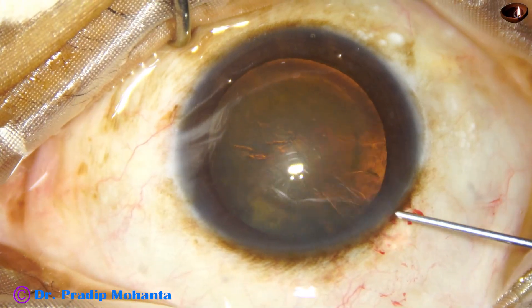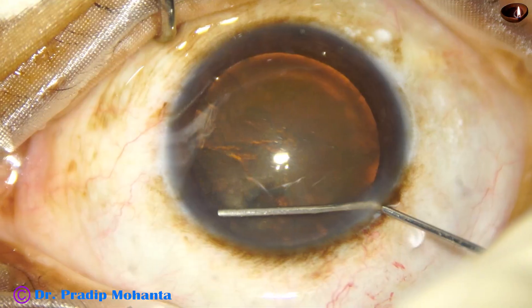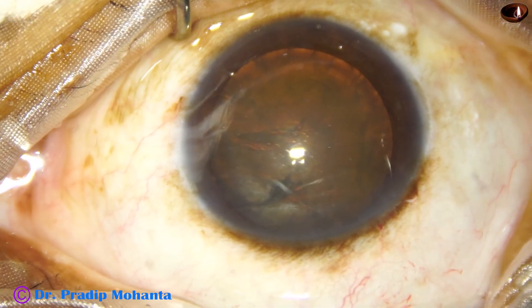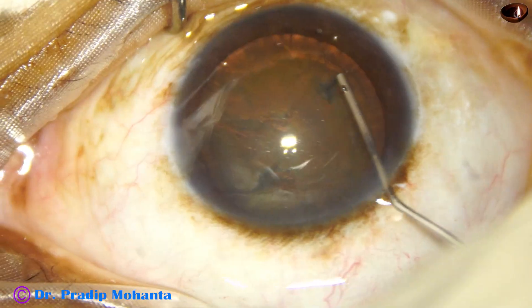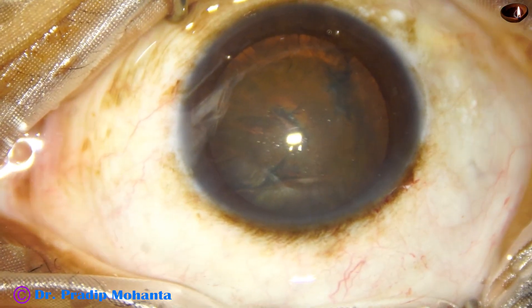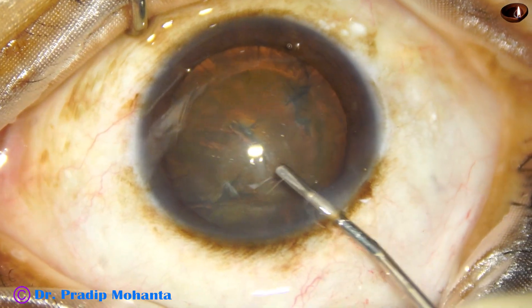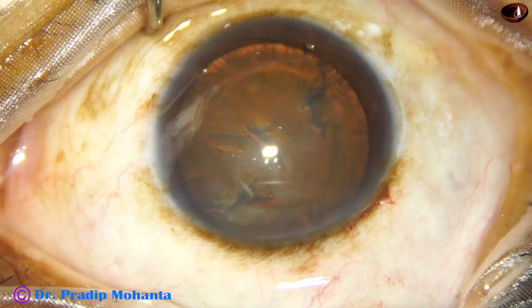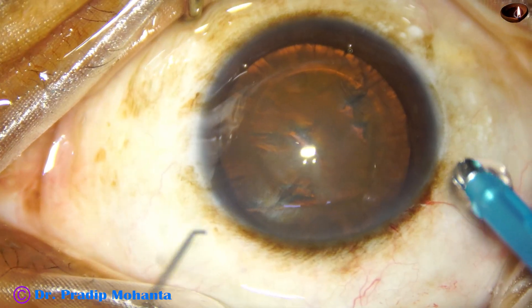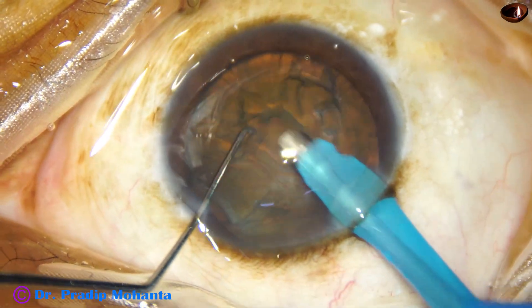Now hydrodissection is done with a BSS and 27-gauge cannula. We can see the fluid wave going from one side to the other side. There is a faint red glow. This is not a Lumerati — this is Topcon's OMS 800, having a fairly good glow.